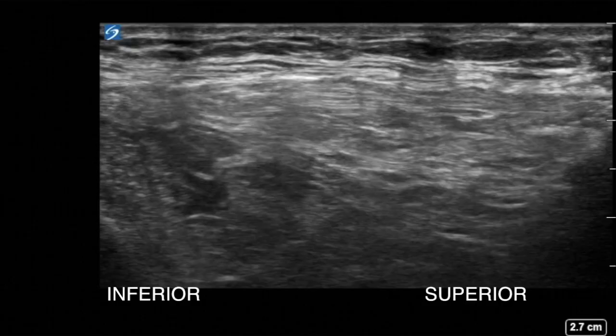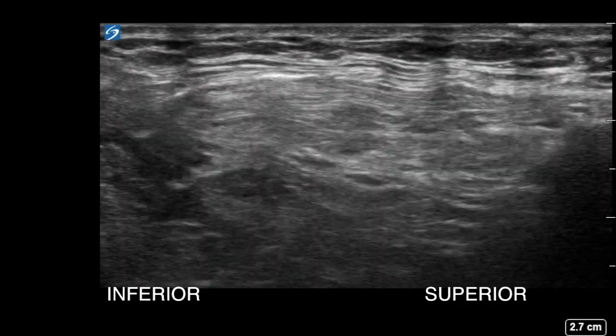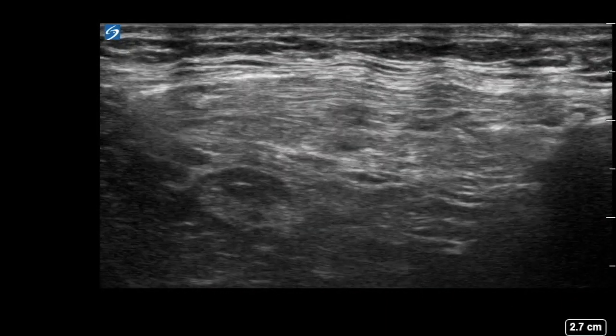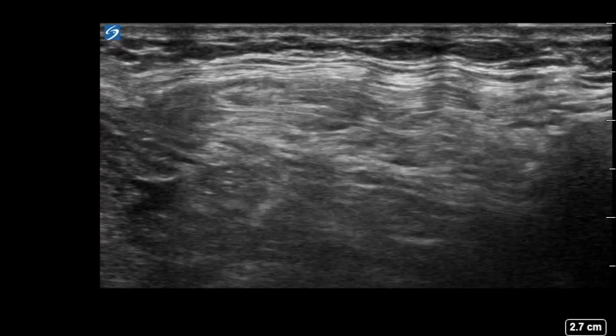Here is another view with the probe placed slightly more medially, with the anterior inferior iliac spine, iliacus, and fascia iliaca clearly seen. When the local anaesthetic is injected, the iliacus muscle is clearly peeling away from the fascia iliaca, with the local anaesthetic tracking down into the pelvis.